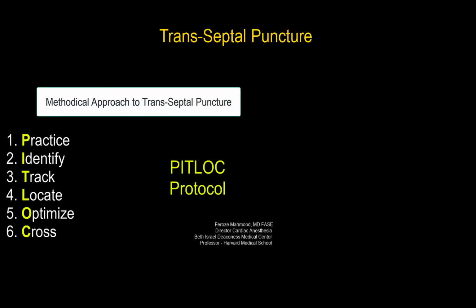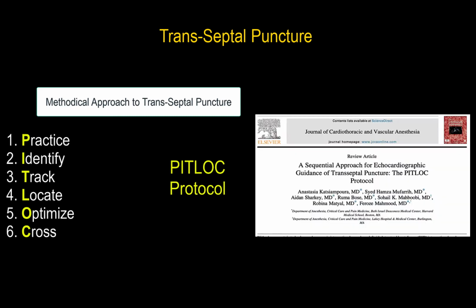Okay, Feroz, so moving on to our transseptal puncture, we've already decided that it's going to be a difficult procedure to optimize. What sort of protocol do you use to guide the transseptal puncture in order to ensure an optimal crossing?